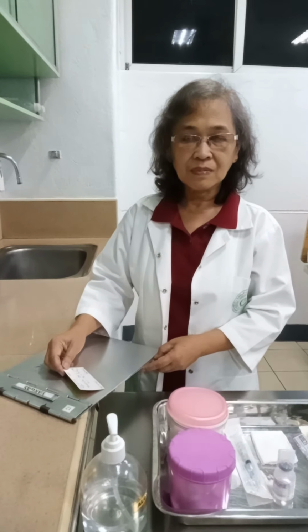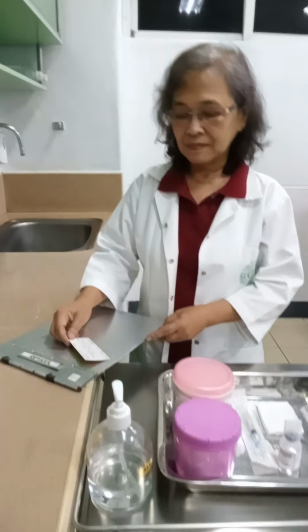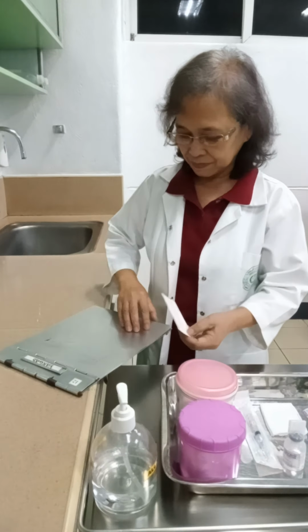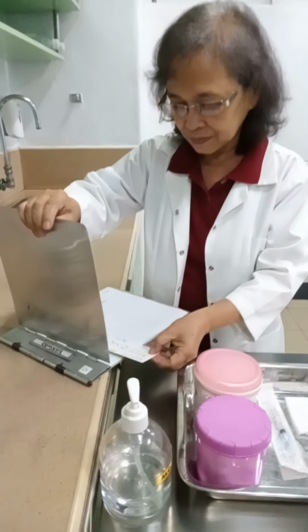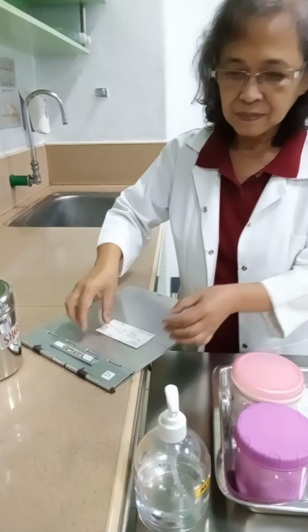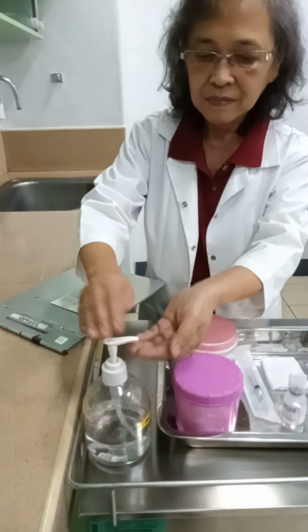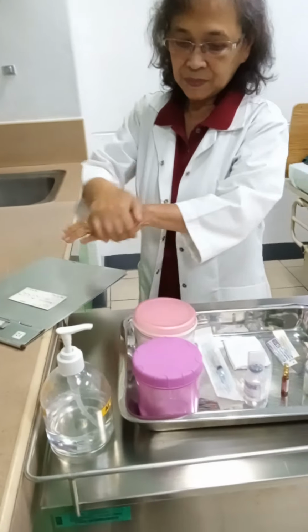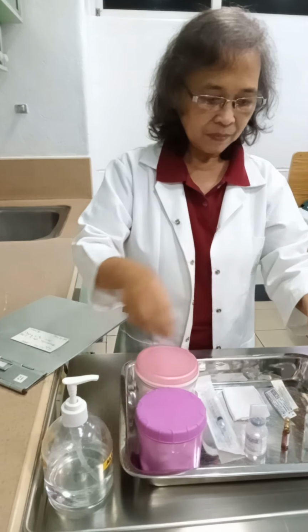Withdrawing medication from a vial and ampule. Obtain the medication record and drug card of the patient. Wash hands. Prepare equipment and assemble in the medicine room.